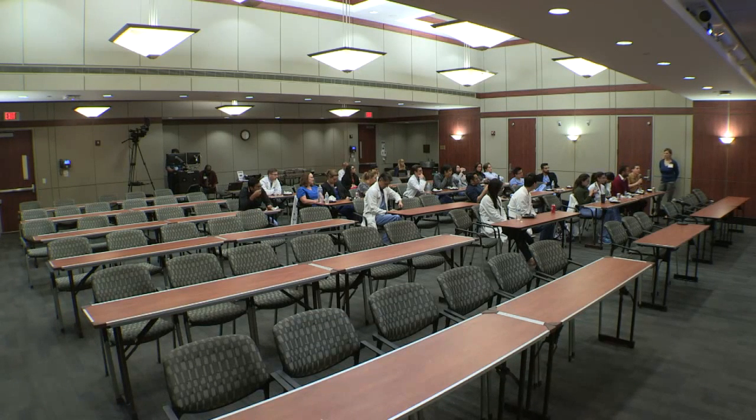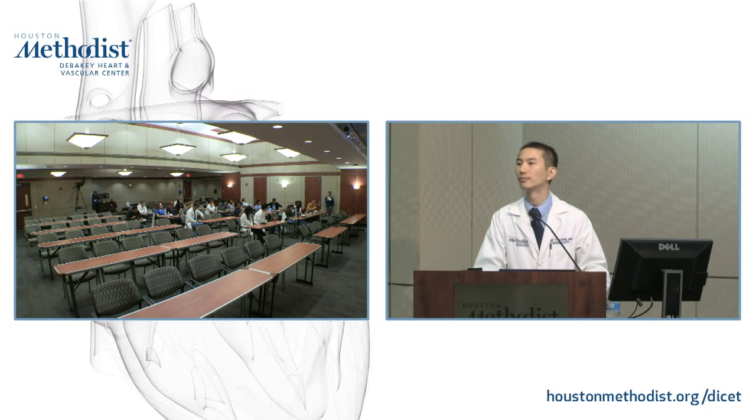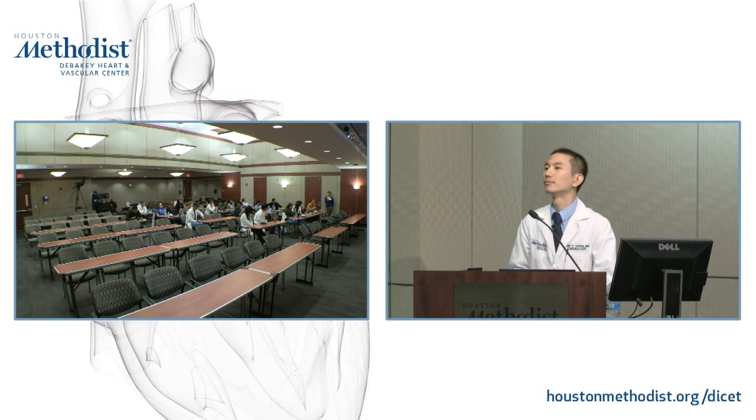Thanks, Dr. Yang. Great talk. Just a question out of curiosity, where do you see the role of stress CMR in terms of triaging patients presenting to the emergency room with chest pain? Because there's data about that. I don't know if it's just more in use in Europe versus the States, but is that something that you think will be used more in the future? Do I potentially see stress CMR being used in the emergency room setting?